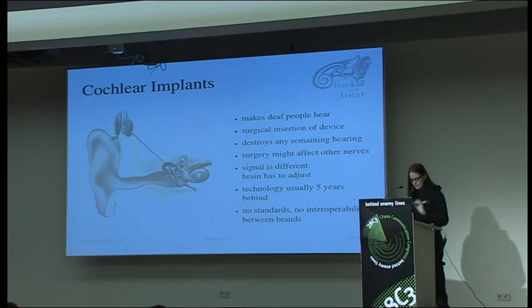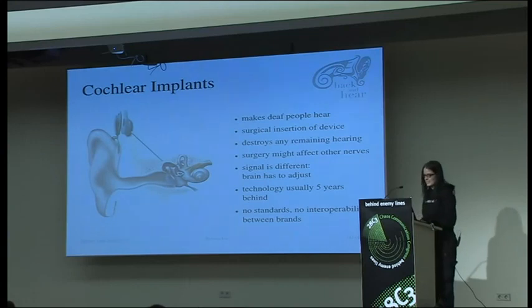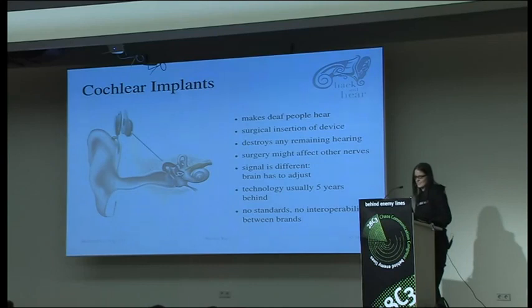I have an example of how it sounds with a cochlear implant. So it sounds kind of spooky. It starts with a normal sample that everyone can hear, and then they have different channels and reduce the number of channels, and then it gets less and less hearable.